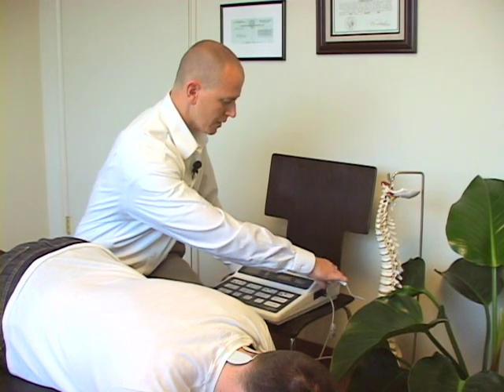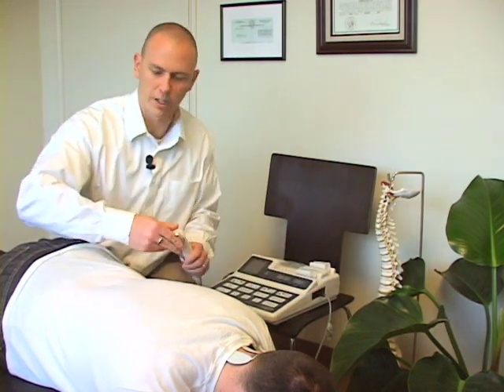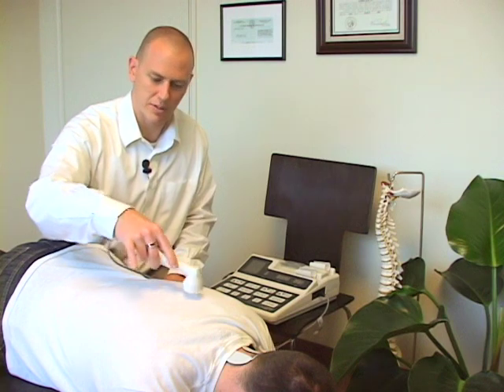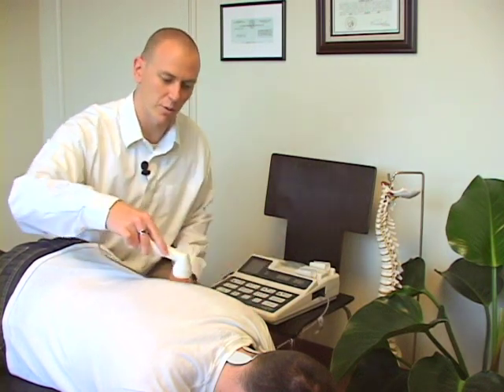With the ultrasound unit, we're going to take the wand, and we can combo this or do them individually. We put some gel on the area in question, set this for 3, 4, or 5 minutes — whatever the case may be — and we basically keep the wand in motion over the area of the soft tissue and musculature that we're working on.